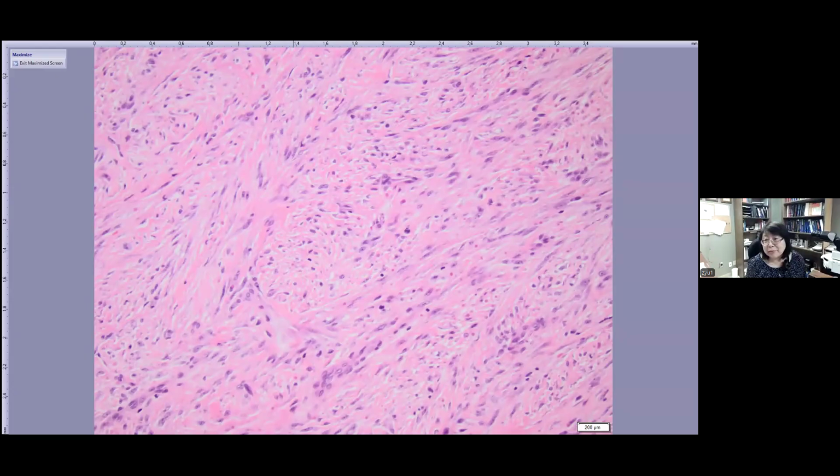So this morphology probably kind of looks like adult desmoid fibromatosis, myofibroblastic proliferation, those pink cells, plump spindle cells, nuclei. But if you think about this case, it's on the toe, sometimes in the finger, as characteristic location. It's an infant, 1-year-old, young infant, finger or toe. Makes you think about fibroblastic proliferation with this kind of morphology. There is one thing you have to remember on this lesion. So go higher power to look.